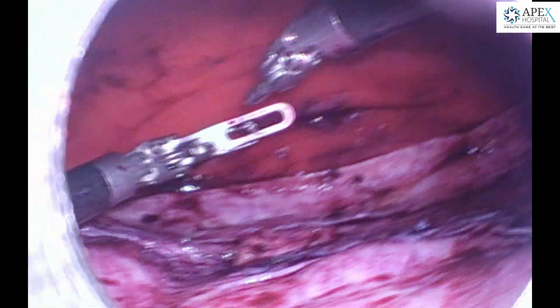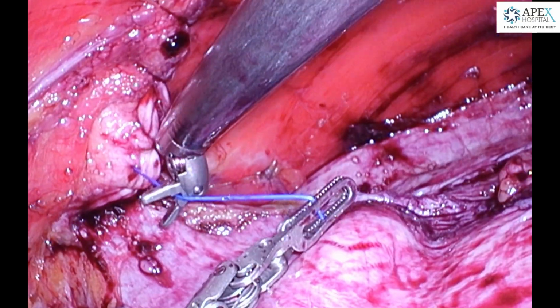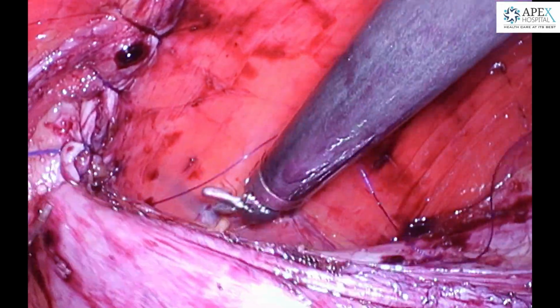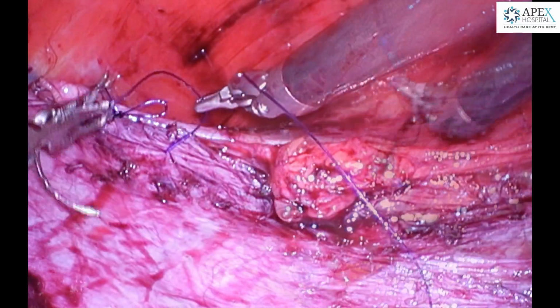Following this, a monofilament PDS suture 2-0 is inserted for closure of the small peritoneal rents that were made during the dissection of the linea alba.